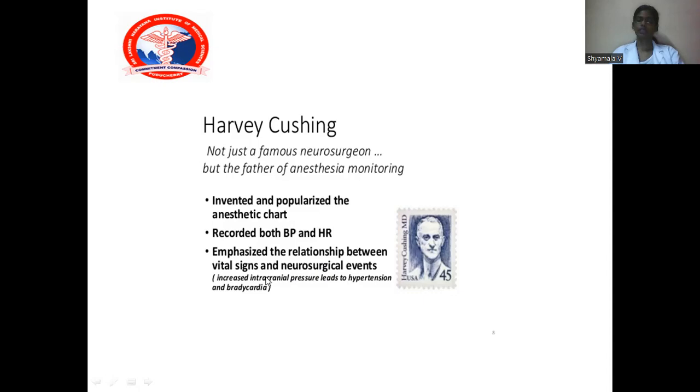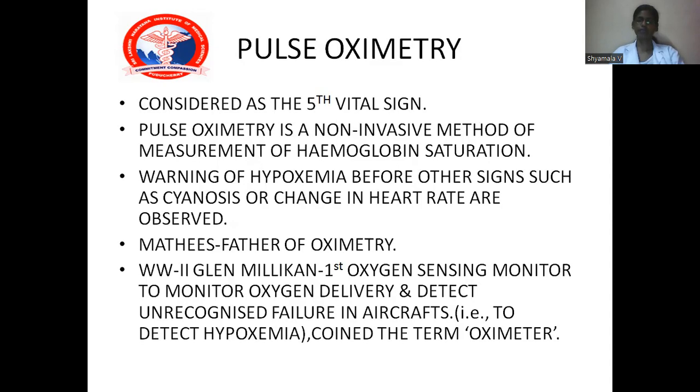And he concluded that increased intracranial pressure can lead to hypertension and bradycardia. So coming to the main topic, pulse oximetry. It is a non-invasive method of measuring hemoglobin saturation. It is also called the fifth vital sign.